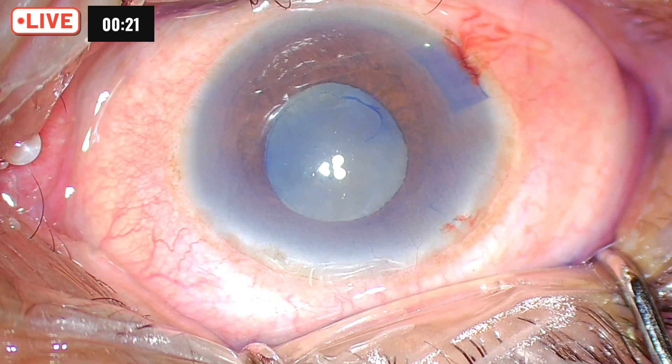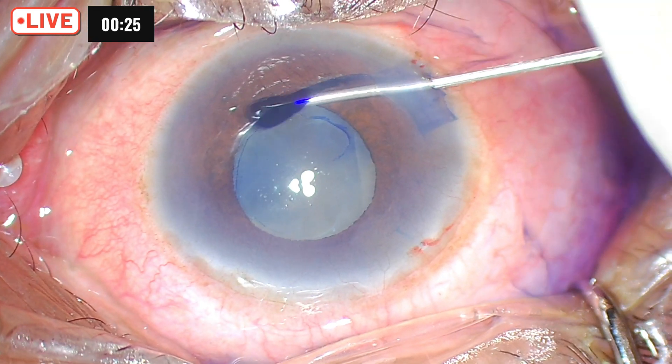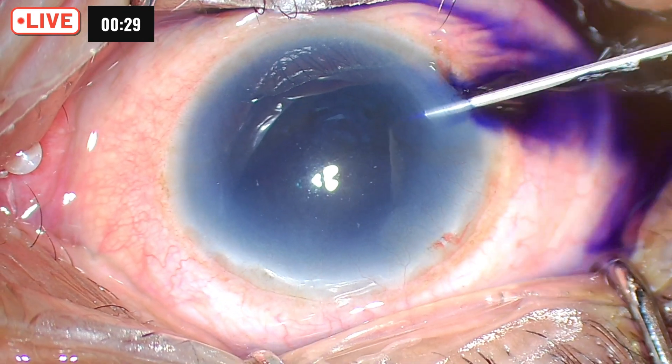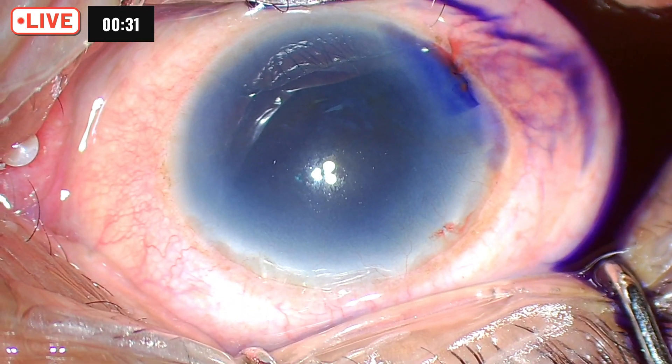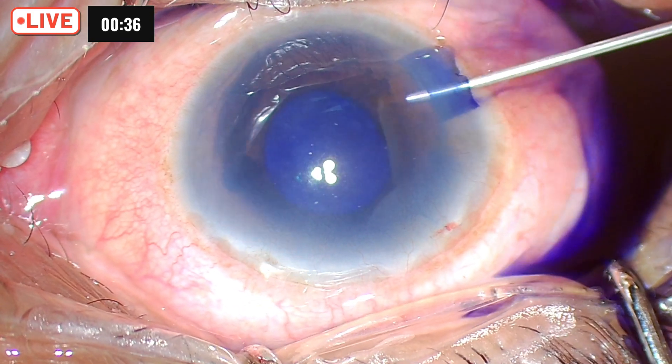In such cases, you will have to make sure — since there is posterior synechiae — as your rhexis is going to the periphery, it is a good idea to break the synechiae in one area and push some dye behind the iris. That will stain more of the capsule.